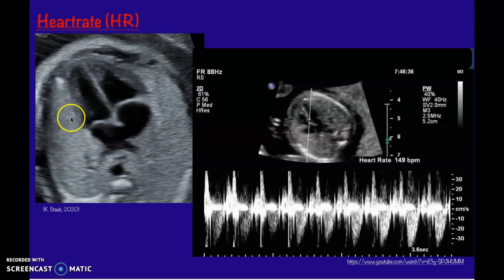So this image you do not have to take. I just thought this would be helpful to blow it up a little bit. So here we see the heart, and we can see aorta and spine, and again baby's abdomen. So we know this is the left side of the heart because it's the closest to the spine. So we know this is left atrium, right ventricle, and left ventricle. So again, like I said, you want your cursor to be going through an atrium and a ventricle.